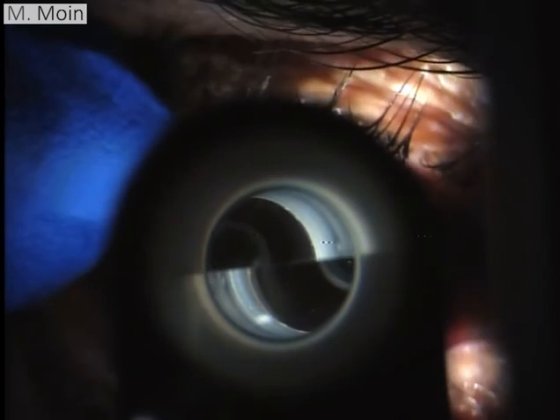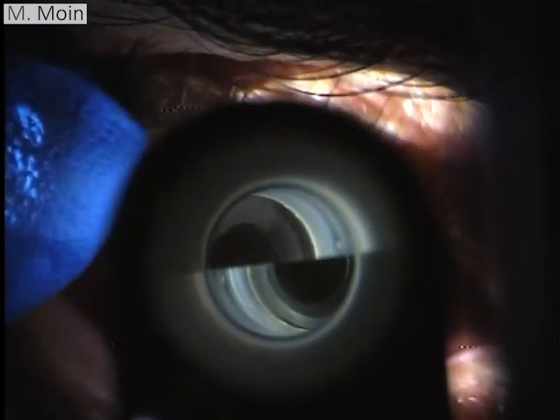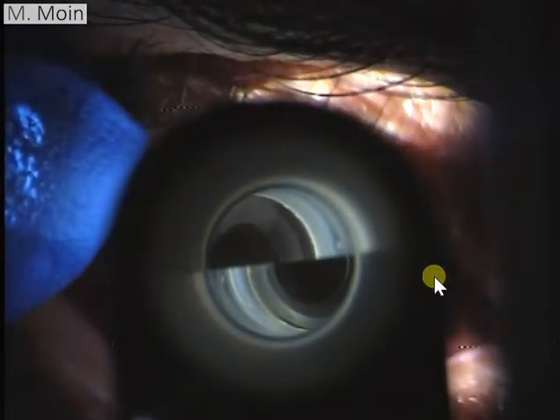And the important thing when you're checking for intraocular pressure, you look at the mires. So you see the mires are touching, and they should be touching inside out like this. If the mires were not like this, and when you started off the mires were far apart, that means that the pressure is high. But if the mires were overlapping too much, that means the pressure which is recording is too low and you need to raise your reading.